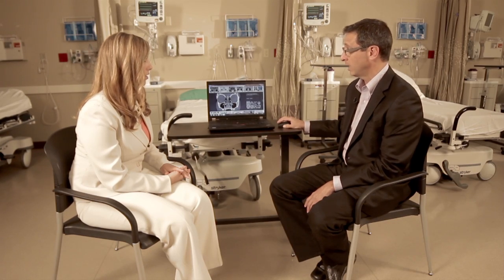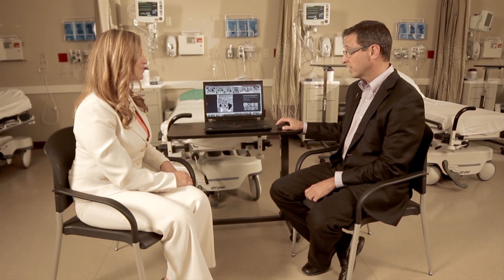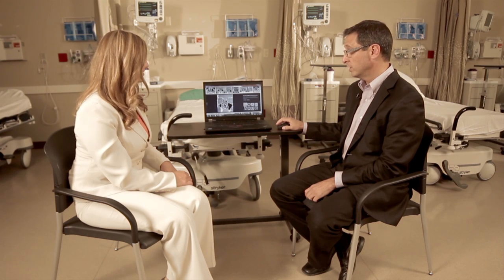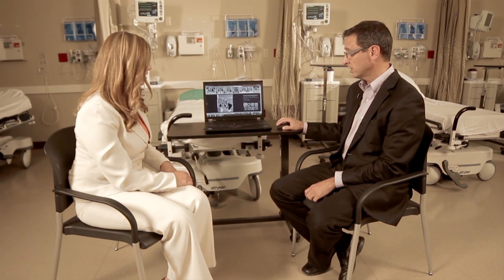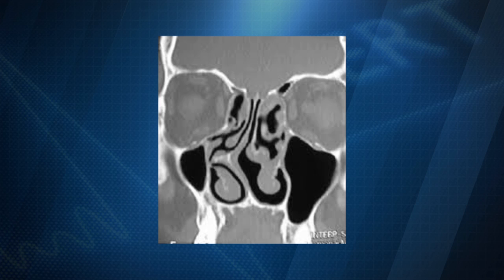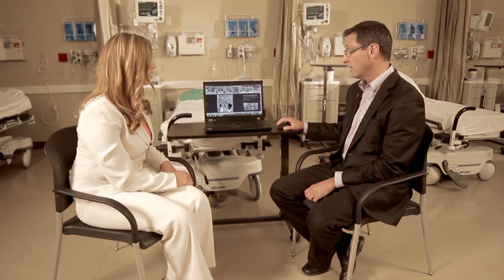Unfortunately, not all people have this kind of normal x-ray. Here's a CAT scan of someone with a deviated septum. Here are the eye sockets and here are the cheek sinuses. Look at that wall — look how far over it is deviated to one side. That is going to block their sinuses from draining effectively. This is going to cause stuffiness and congestion, can lead to sinus disease, and this is why people end up in my office.